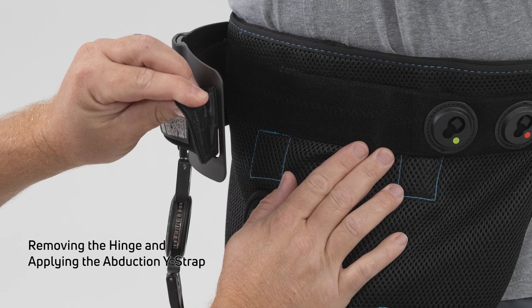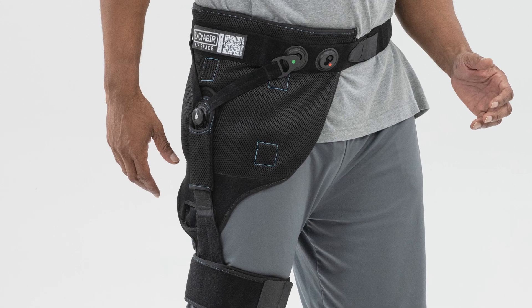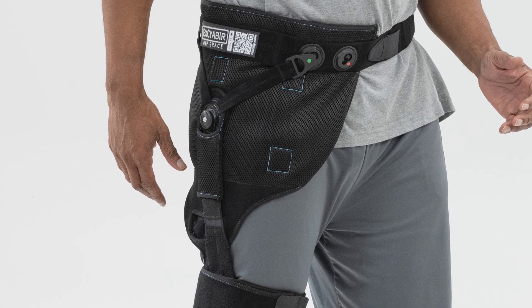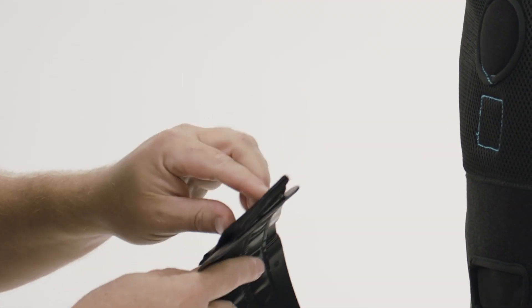If instructed by a healthcare provider, the hinge may be removed and the abduction Y-strap installed. Note: it is not recommended to use the abduction Y-strap with the hinge. The hinge system is attached by velcro to the soft brace.